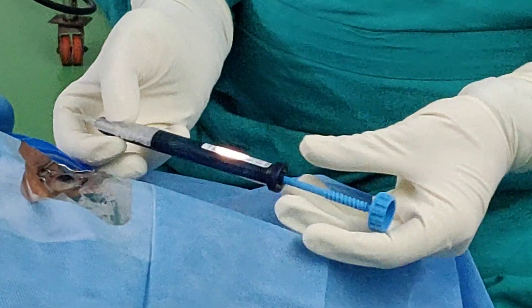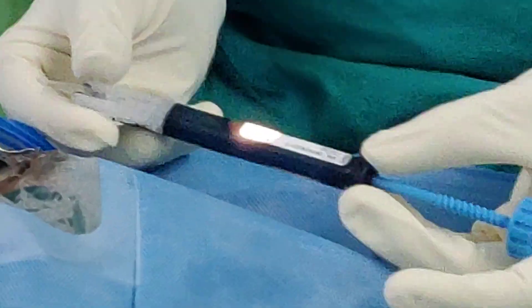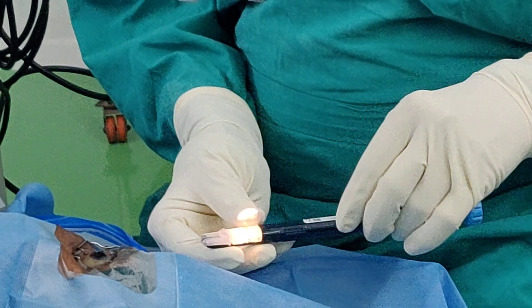This is the Simplicity Delivery System. The power comes from the adapter. This is the one-piece lens. This is the plunger with the screw mechanism. And this is the hydration port.